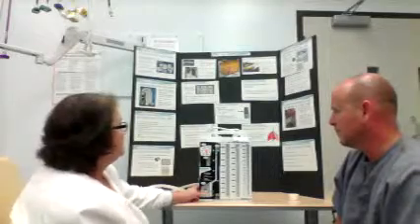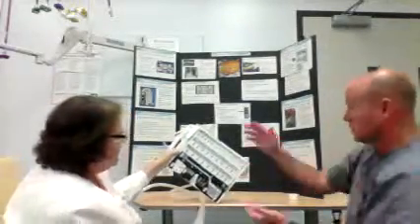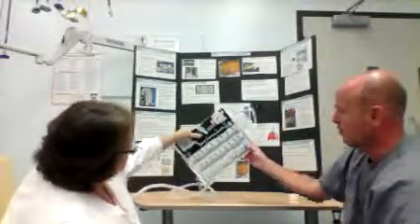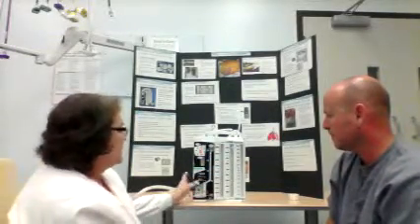Okay? So what if you have it on the floor and the patient gets out of bed and tips over? You can lift the system back up. The way the chambers are done, you turn it basically on its side to the right, and everything is going to go back. This manufacturer recommends that you turn it to the right, so do follow your manufacturer's instructions. Most of your fluids should go back to the chambers that they're supposed to be in. Again, if that doesn't happen, if you feel like the system isn't working correctly, then you need to replace it.